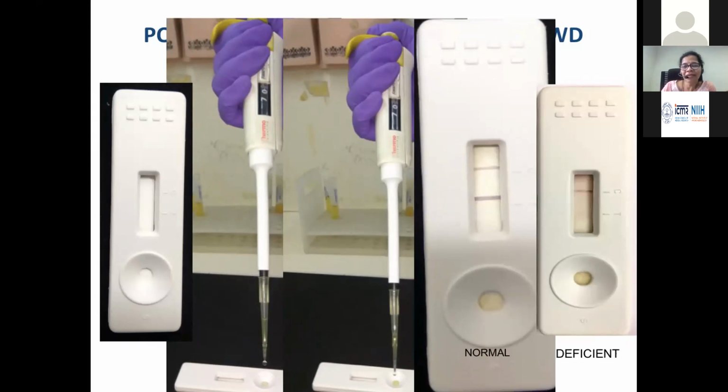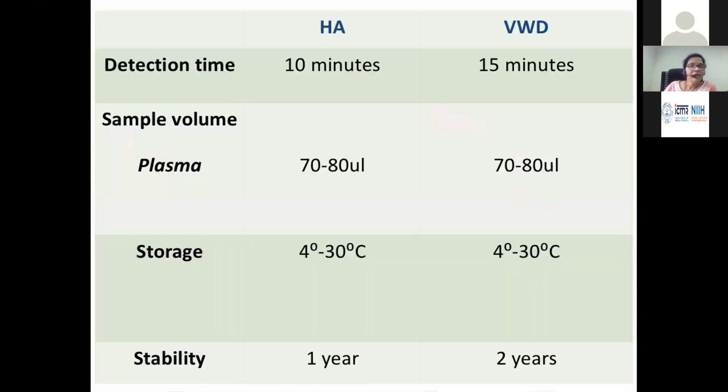Pretty simple, a 10 minute test. You don't need any machine. The diagnosis can be given anywhere, in any place, as long as you have the plasma with you. So the final standardized thing is for HA, the detection time, you load the plasma.